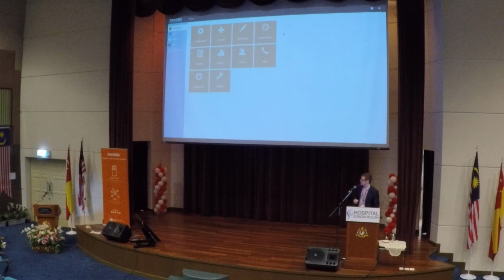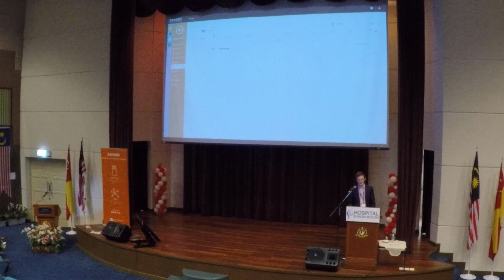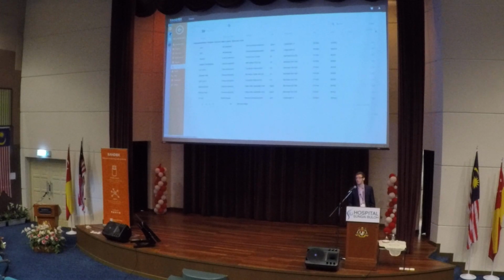So today we aren't going to go through every single tab because that would take a little bit too long, but we're just going to highlight some key things that your lab may be interested in looking at on a fairly regular basis. So the first thing we have is our charts, where we're going to look at our Levy-Jennings histogram and performance summary charts as well.